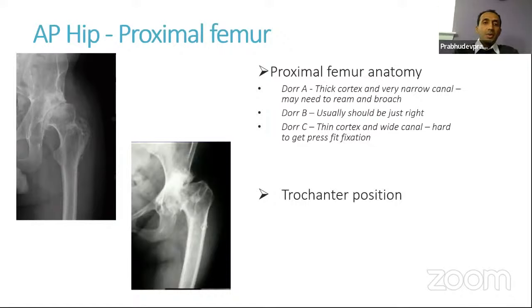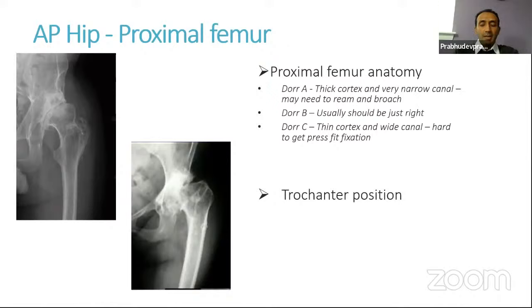We can also assess the position of the trochanter — like in this one there's a significantly deformed proximal femur, a really valgus type of femur. All these things will help us in appropriate planning.